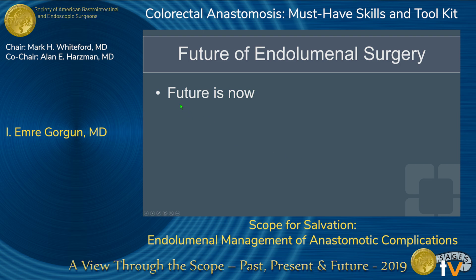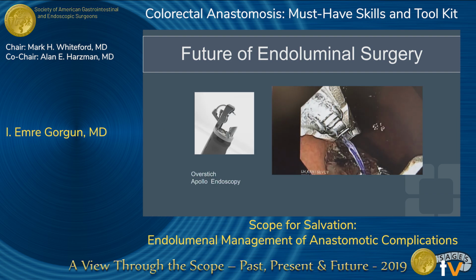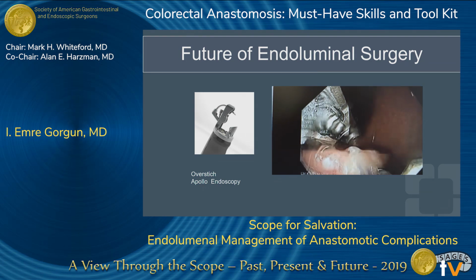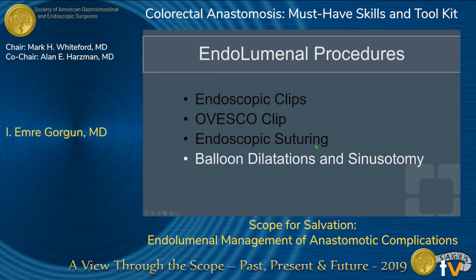So this is really where I think being able to close the defects will take us to the next level and into endoluminal surgery. This will enable us to close defects after the procedures we perform. Here you see that in action, how that's performed.